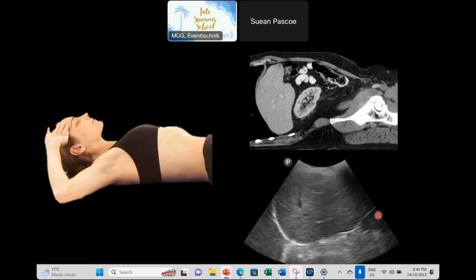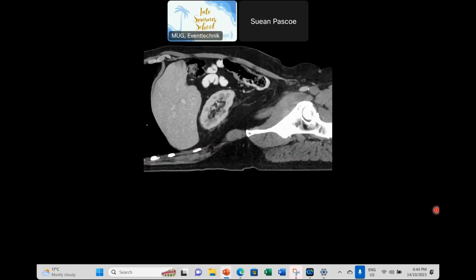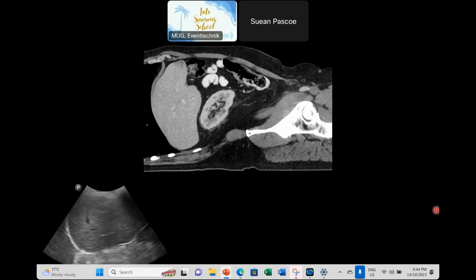and then we can see just the top of the kidney here. And what that's going to do is let me look in the 5 really crucial areas where we will see the fluid. Now this is the same for both right and left upper quadrant. We need to look above the diaphragm in the pleural cavity, looking for signs of hemothorax. It will present above the diaphragm on the ultrasound.